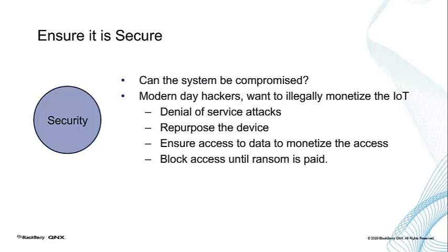Well, there's a lot of things that are going on in terms of denial of service, repurposing the device, access to the actual data that's on there that might violate HIPAA compliance, and then even heard of cases where access is blocked until ransom is paid. We need to make sure that we minimize that attack surface.